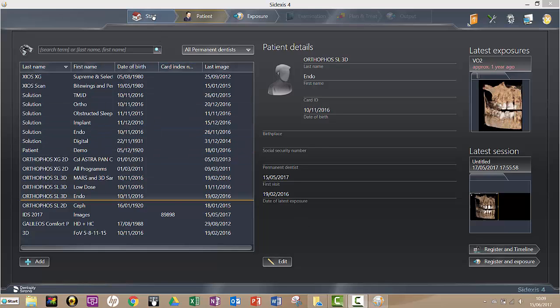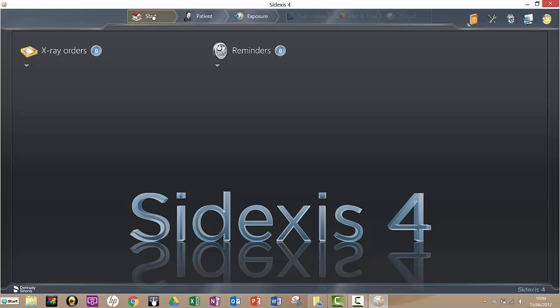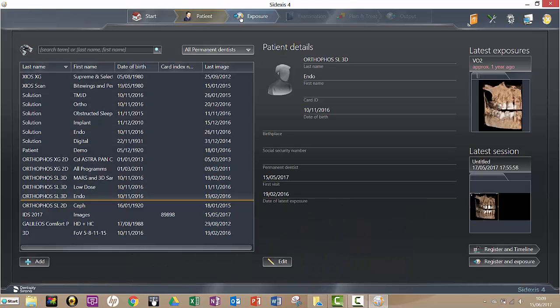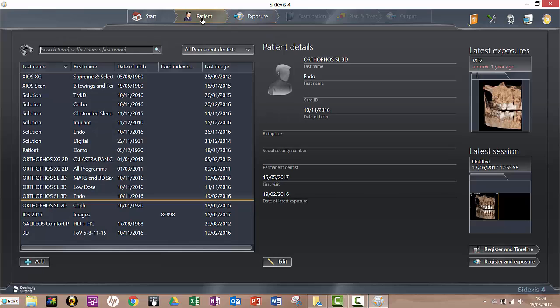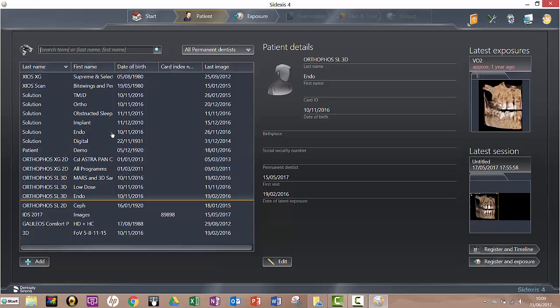You've got tabs here. Start, Patient, Exposure is where you'd actually go to take your image if you had hardware connected. So here I'm in my patient. I've got some strange looking patients here, obviously you also have more normal names, but say this was my patient here and I select the patient.